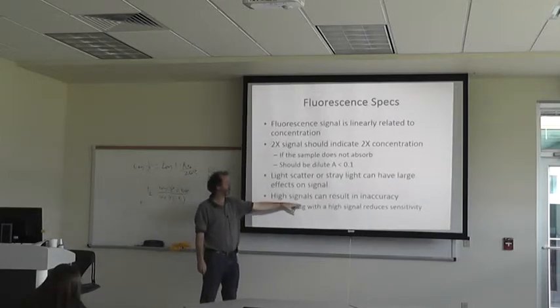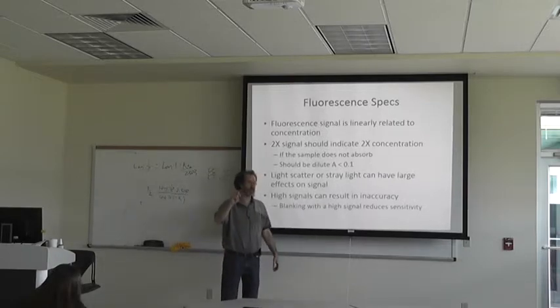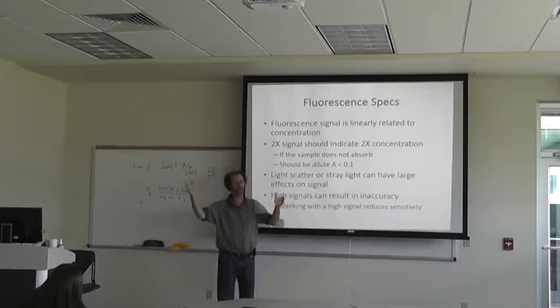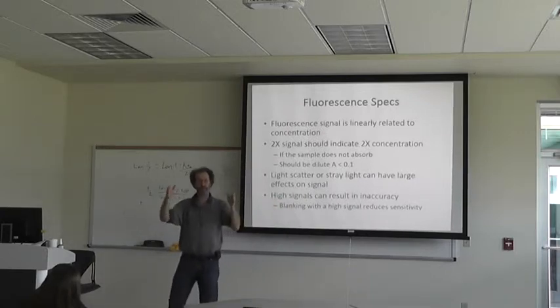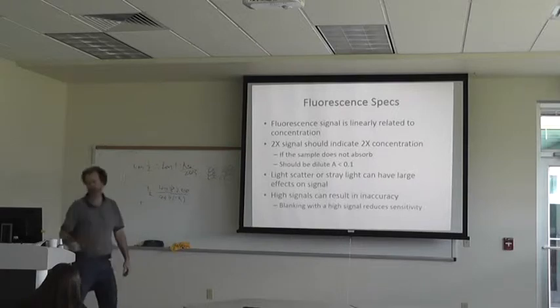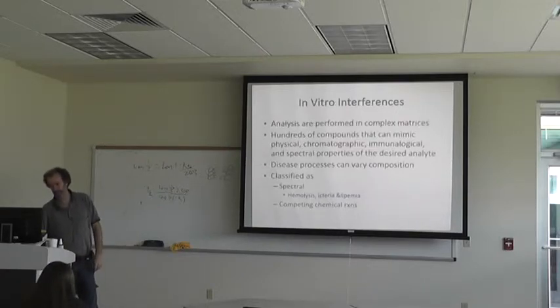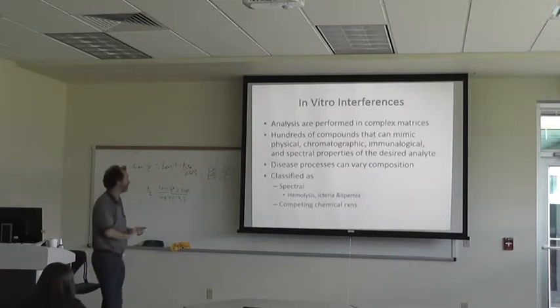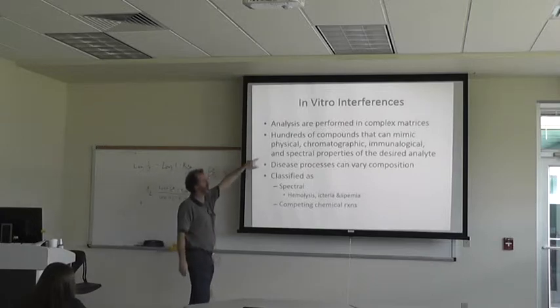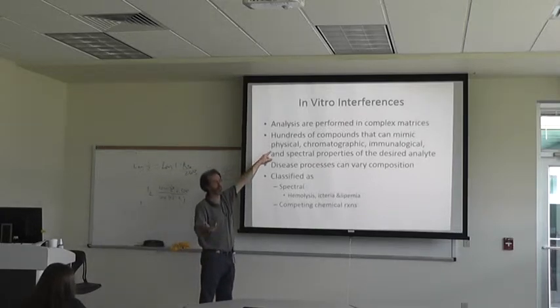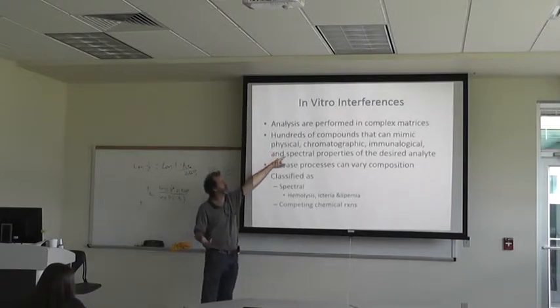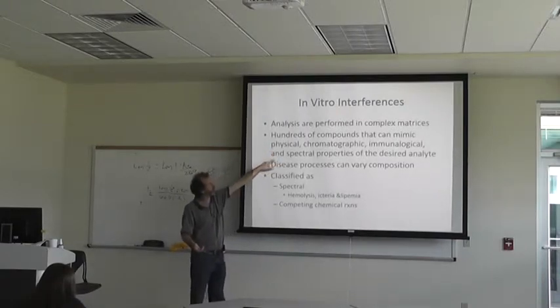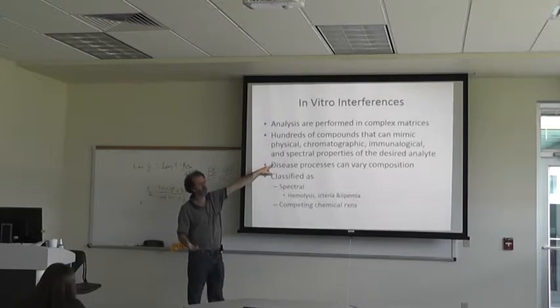If you have a really high signal and your blank has a really high signal too, the difference between the two isn't going to be that great, so it reduces sensitivity. In vitro interferences: analyses are performed in complex matrices — that's the substance like plasma or urine. You have hundreds of compounds that can mimic the physical, chromatographic, immunological, and spectral properties of the analyte. Disease processes can vary composition also.